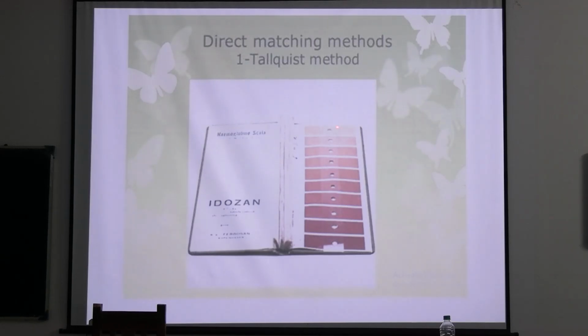Okay, and there is a gross level. If your blood falls there, there will be a level. Hemoglobin is from this gram to this gram, then if this color matches, then the hemoglobin level is between this gram and this gram, like this.